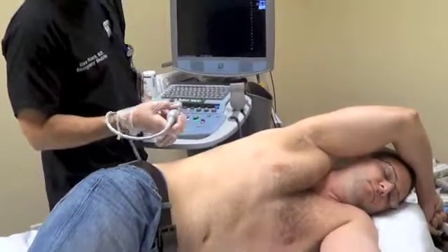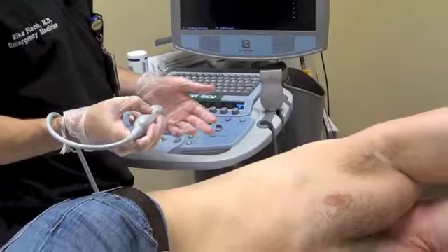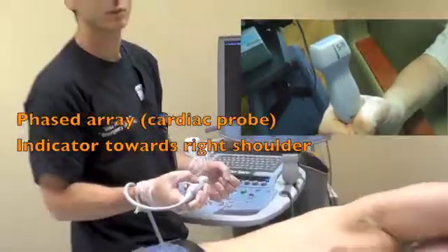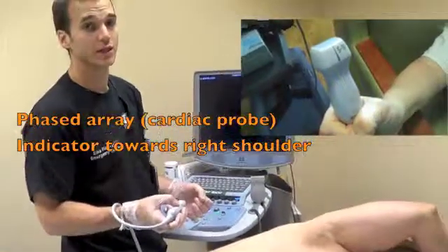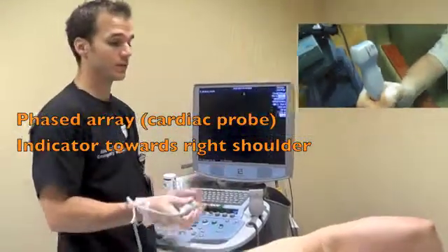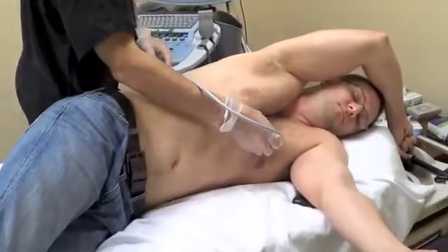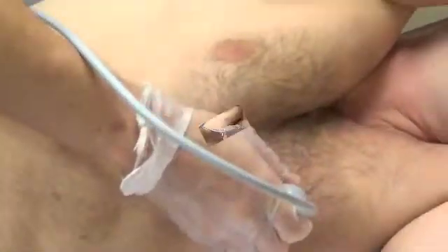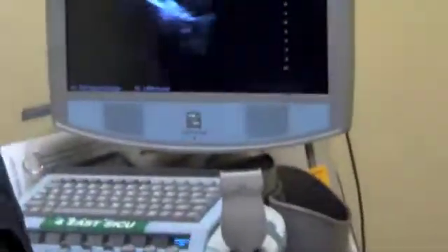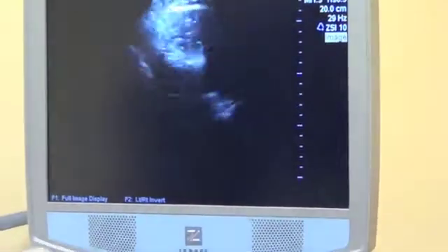The transducer is placed in the fourth to fifth intercostal space with the transducer indicator pointing towards the right shoulder. We rock, fan, and rotate the transducer until we've optimized our image.